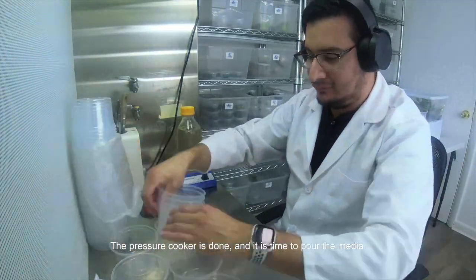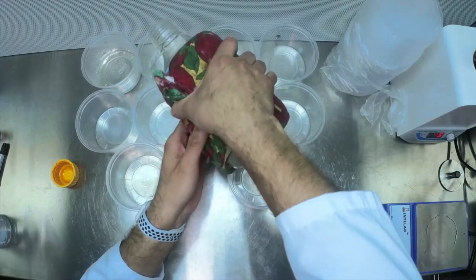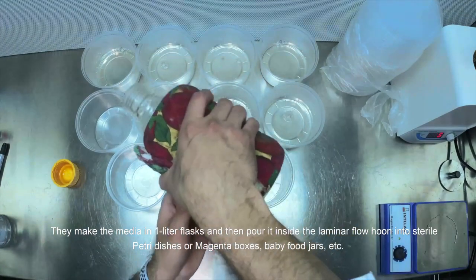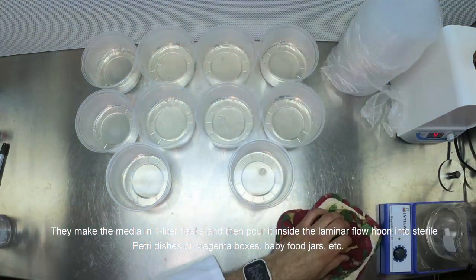The pressure cooker is done and it is time to pour the media. I am going to use deli containers, but you can use any type of vessel. Many professional labs make media this way — they make the media in a 1 liter flask, then pour it inside the laminar flow hood into sterile petri dishes, magenta boxes, baby food jars, etc.